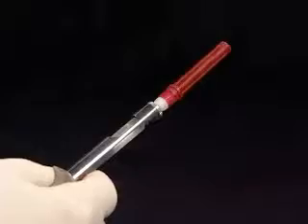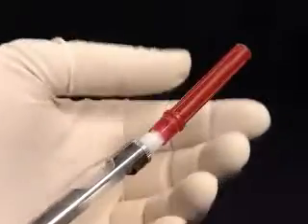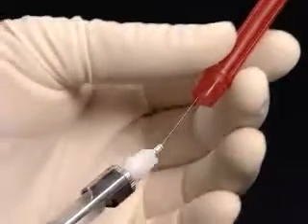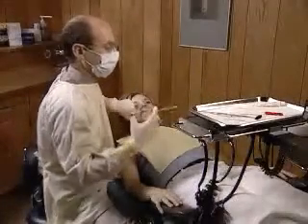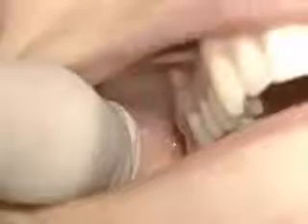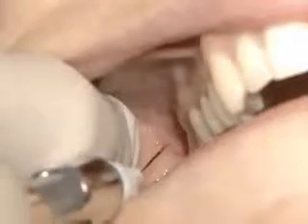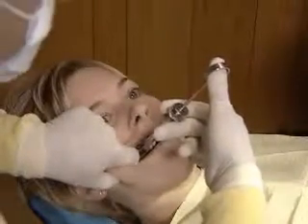To bend a needle, what you need to do initially is to loosen the cap, and then using the cap in a sterile manner, give it one bend and one bend only, removing the cap to determine the final degree of bend. With the jaw closed, the teeth together, the syringe inserts into the insertion point against the posterior mucosa. Once it's advanced in, the angle is corrected. The needle is advanced back posteriorly 25 millimeters.